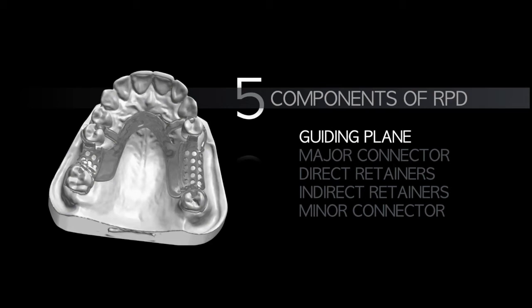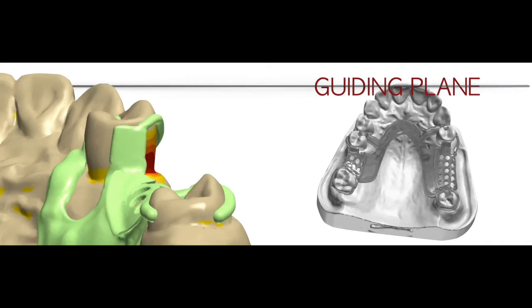The five components are: guiding plane, major connector, direct retainer, indirect retainer, and minor connector. These are the sequence you follow to design any partially edentulous condition. Let's look at the first component—guiding plane. The guiding plane is the part of the metal framework that engages the proximal surface adjacent to the abutment tooth. In this case, there is one on the mesial of tooth number 15, and also on teeth number 2 and number 4—totaling four guiding planes.